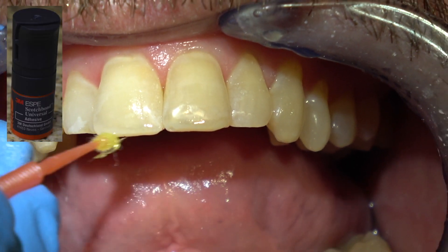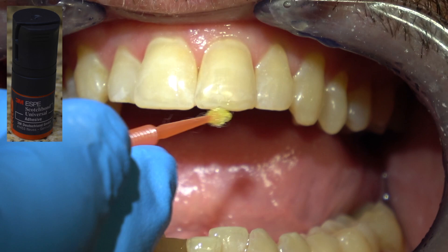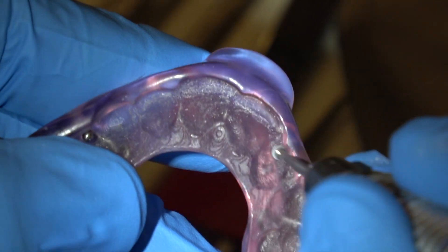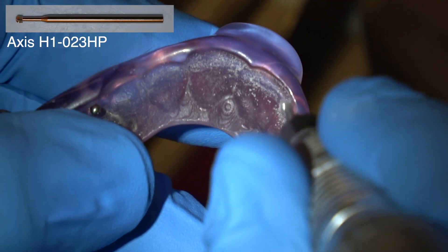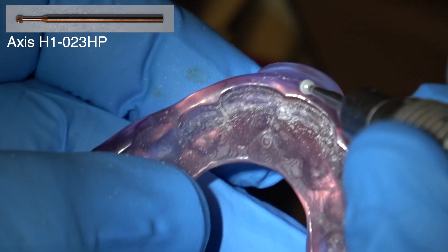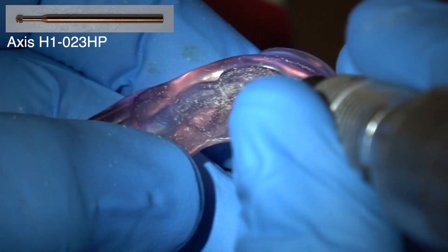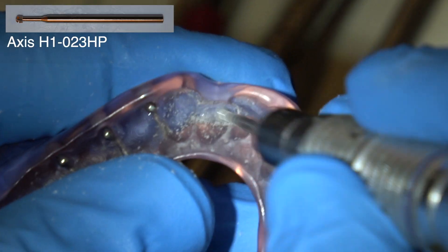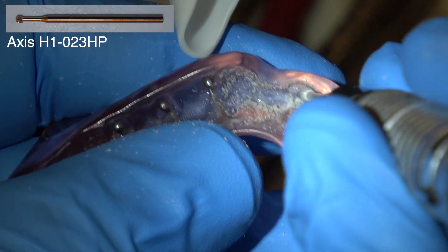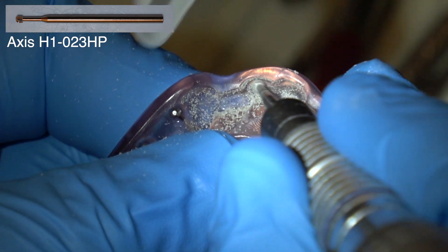This is a sealer. Now I'm going to take this number eight straight shank round bur and open up his dental sleep apnea snoring device just a tiny bit inside the ledges. It doesn't take much because, remember, you haven't lengthened the teeth — the length determinant is the longest part of the incisal of the existing tooth.